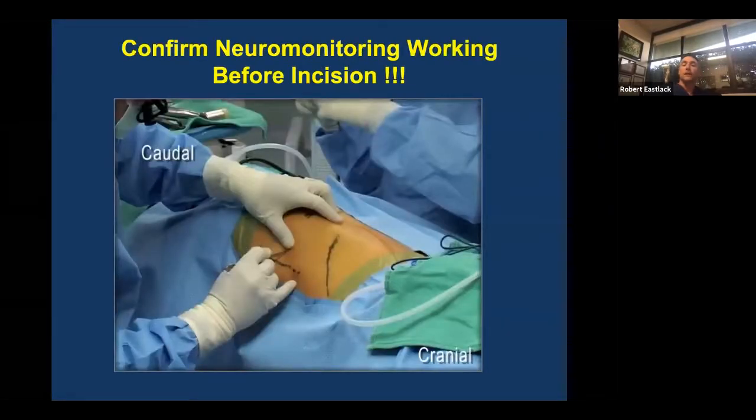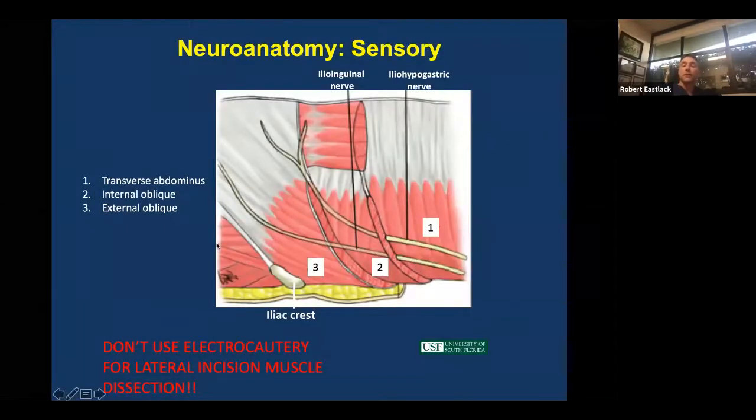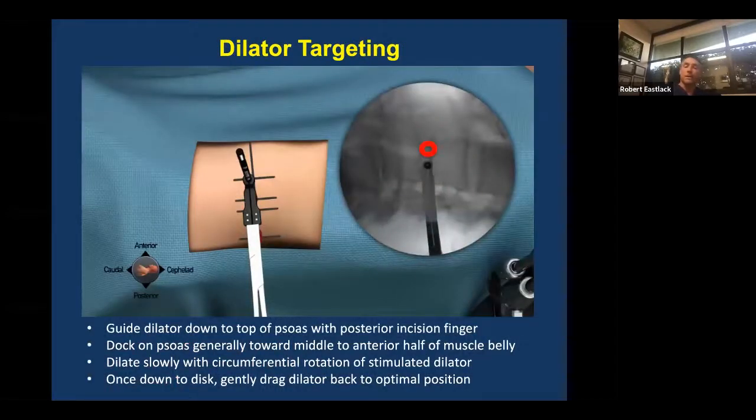Here's the posterior incision being made, and then the lateral incision. Using blunt dissection and transgressing those three structures, you get a typically clear entry through the transversalis — which is more rigid — to a soft, giving-way, very low-pressure environment of the retroperitoneal space. You should be able to feel the inside of the pelvis and inside of the rib. You can usually feel the transverse process and the psoas muscle through the posterior incision. Do not use electrocautery for lateral muscle dissection, as you may injure the nerves innervating those muscle groups — if you violate them with electrocautery, you can create a pseudohernia, which is not well liked by patients. So use blunt dissection alone.